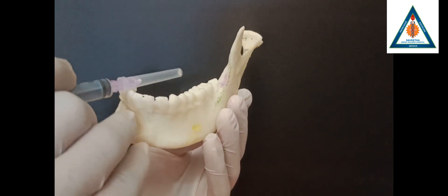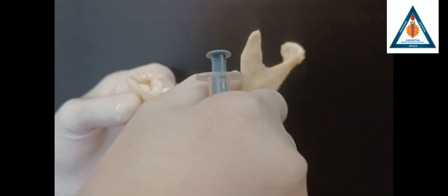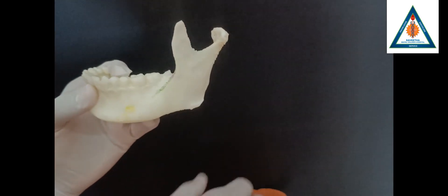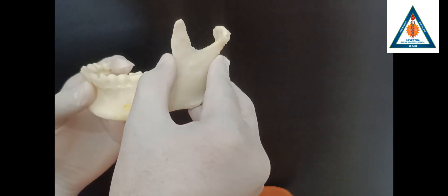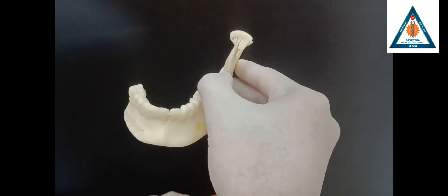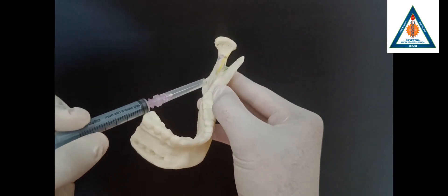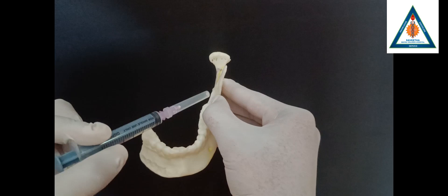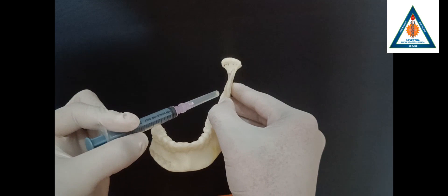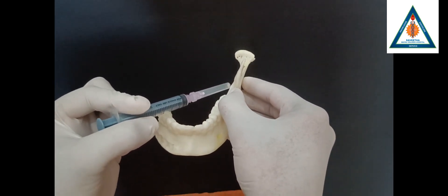Coming to the Halstead technique, what we need to do is first palpate the coronoid notch region. Then all your three fingers have to support the posterior border of the mandible. Once you palpate the notch, you take your needle — and the needle position is very important. You need to remember three parameters: height of the needle insertion, anterior-posterior positioning of the needle, and depth of the needle. These three parameters play a key role.